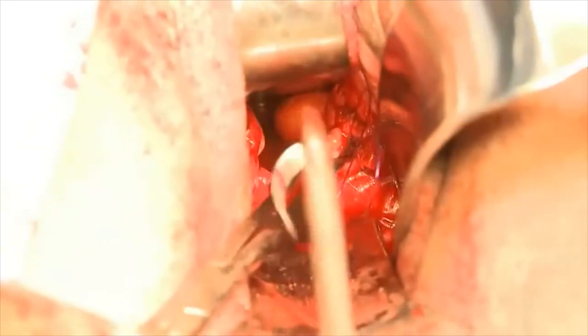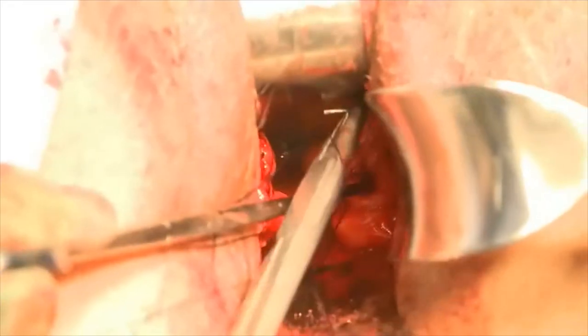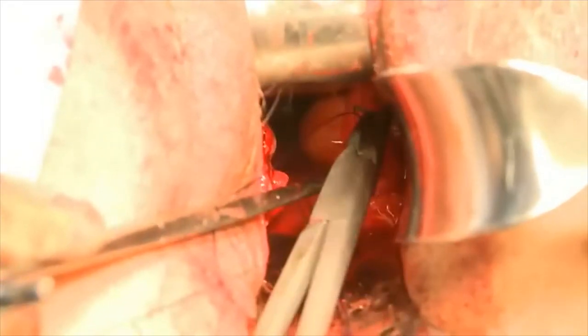The higher you are, the safer it is, and the further away you are from the ureter. The concern here is to be either too close to the ureter or around the area of the ureter, which may potentially kink the ureters.